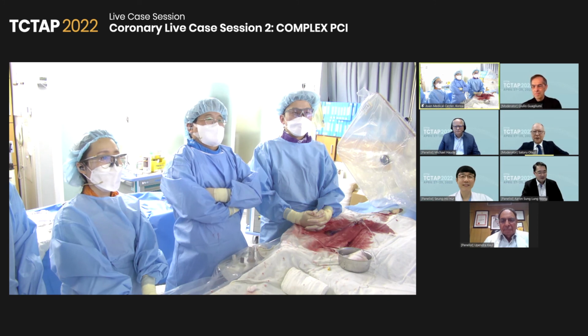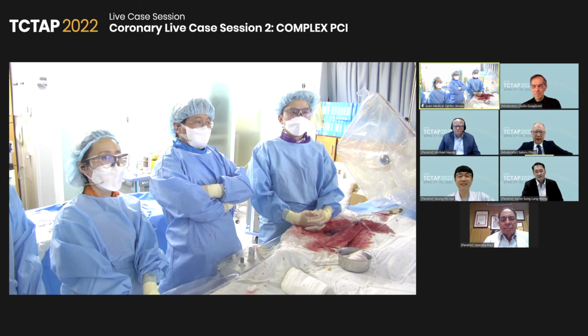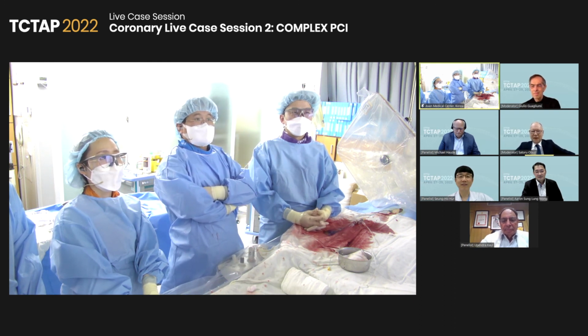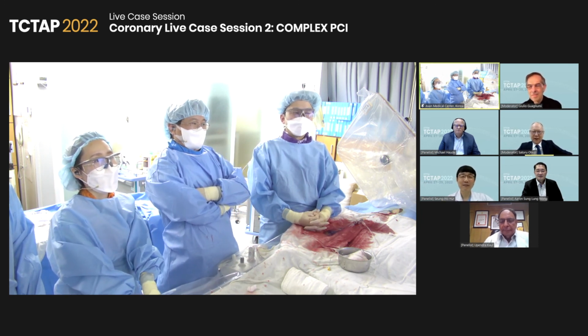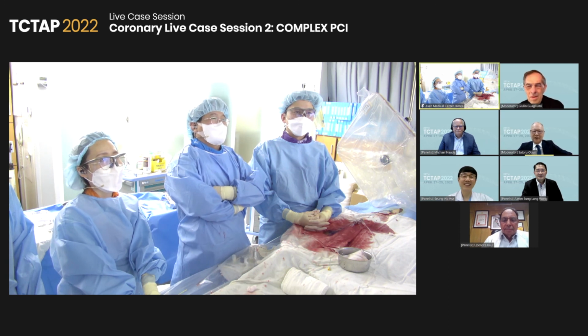Satoru. Okay, congratulations on these two cases. I appreciate your very wonderful result. So please continue the procedure for the patient for the left main and show us the big data for the left main stenting, including the imaging.